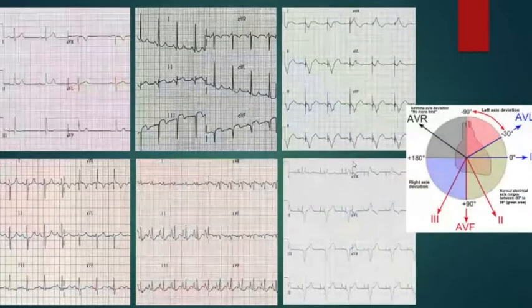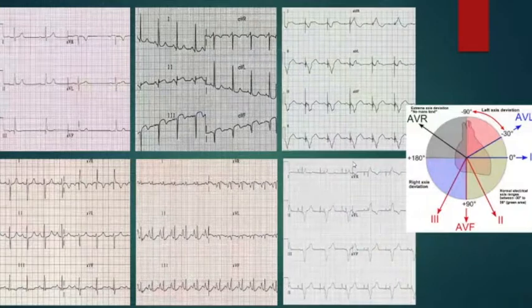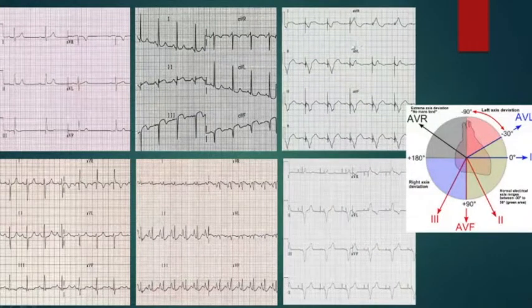Do you find something bothering in this EKG? There are several things that bother me. First is that the QRS complex is a little bit wider. So widening QRS, it's a bundle branch block. You could be right, but this should have a pacemaker or something. Yes.